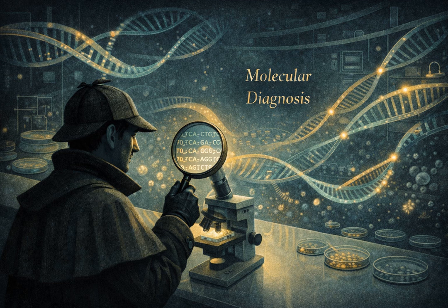But what if you don't? What if you are looking for that classic needle in the haystack? A tiny amount of virus in the blood, or just a few bacteria in a urine sample. Then you need a bigger machine. You need Section 2, the Xerox machines. We are moving from simply finding the target to nucleic acid amplification, or NAA.